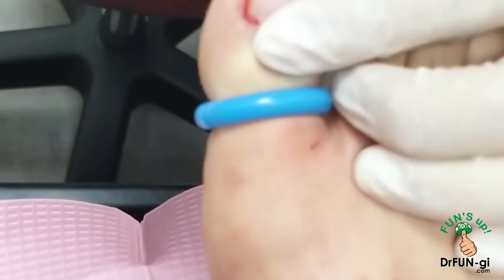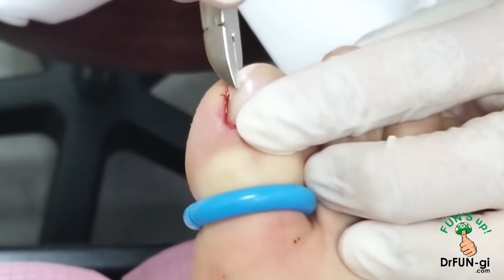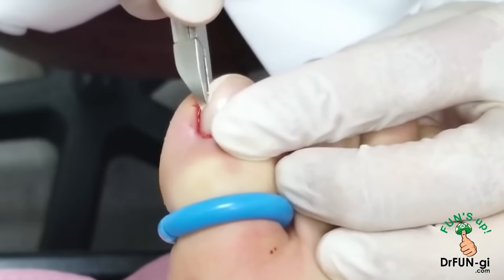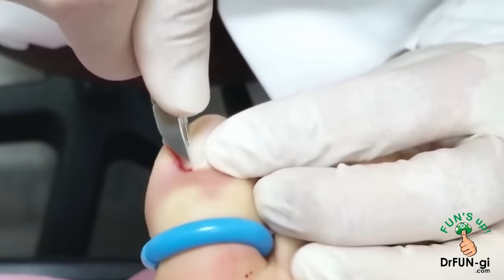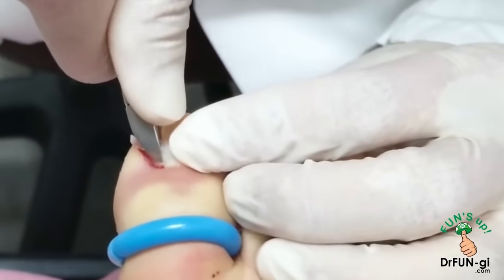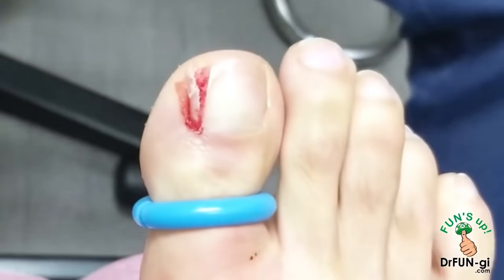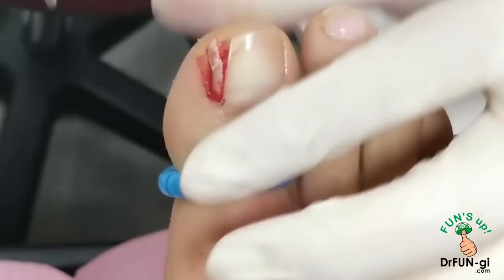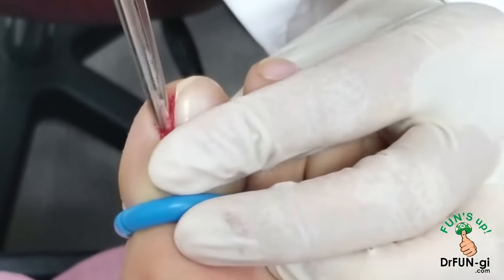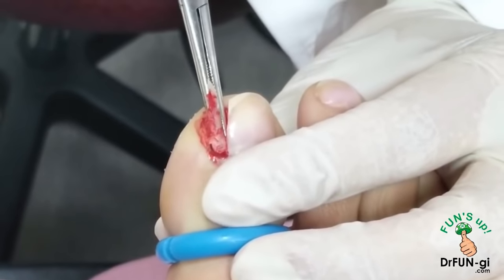Now I clip the nail right here and go straight down — we want to make this very straight so it looks good, all the way down to the base of the nail. We have to make sure we get all the nail in the back, and then we use a little hemostat to take this nail all the way down, flip it over like that, and the whole nail comes out.